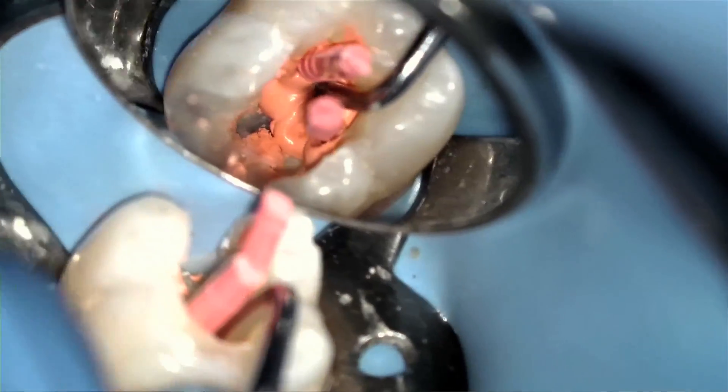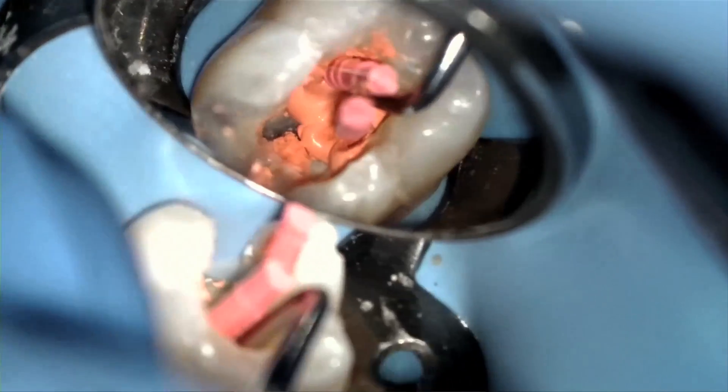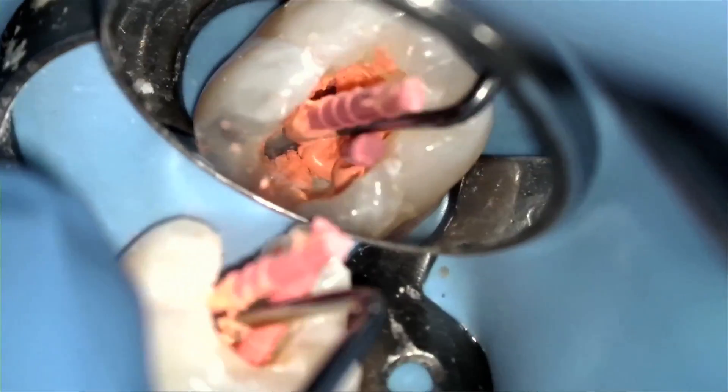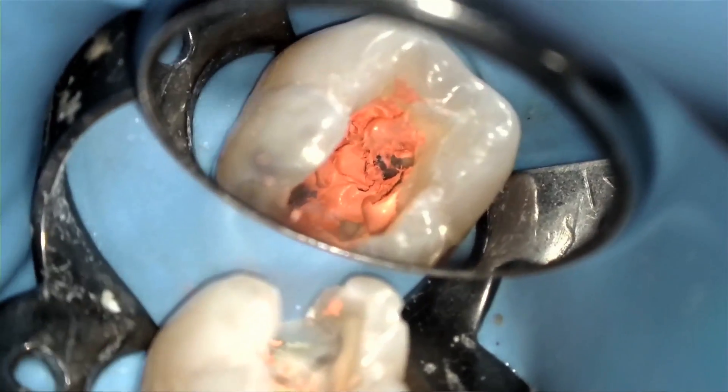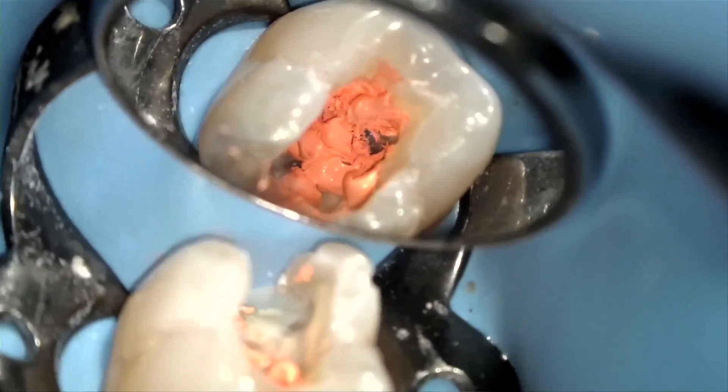To remove the gutta core carrier at the level of the canal orifice, I personally like to use a sharp carry spoon excavator and sever the gutta core at the canal orifice. As you see in the video clip, you may do this in an apical and lateral direction.